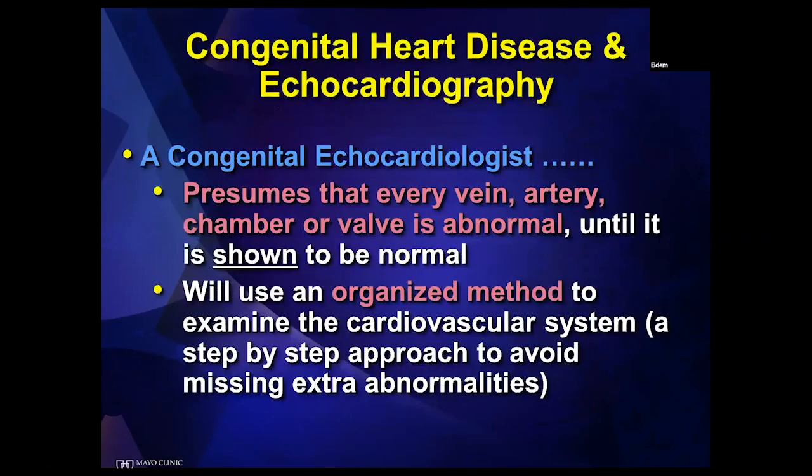So let's get going with our first talk. A congenital echocardiologist is one who presumes that every vein, artery, chamber, or valve is abnormal until it is shown on our echocardiogram to be normal. We will use an organized method to examine the cardiovascular system in a step-by-step approach to avoid missing any extra abnormalities that may be present.